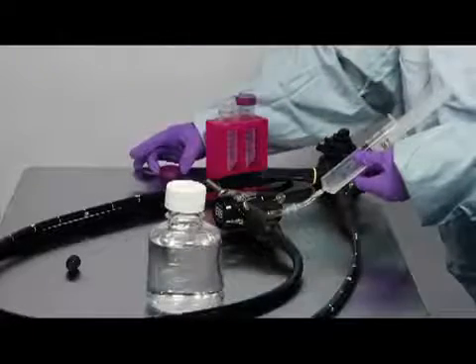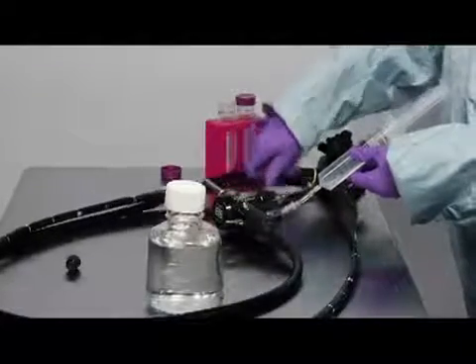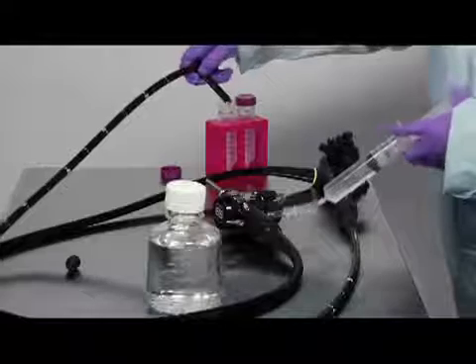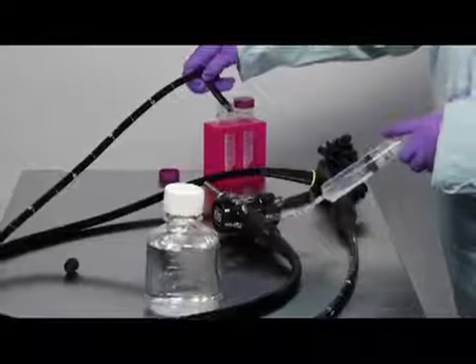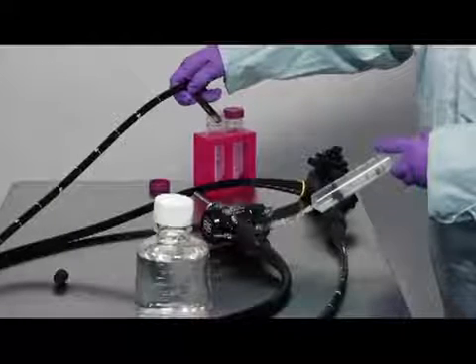Now you have a hand free to actually hold that distal end into the sample cup while you push the water sample through the scope. Again, you do not want that black distal end in the sample collection tube to go below the 40 mil mark, or you'll contaminate your sample.